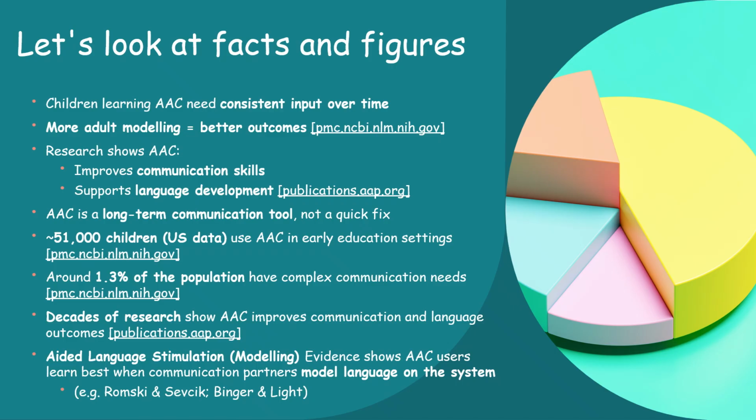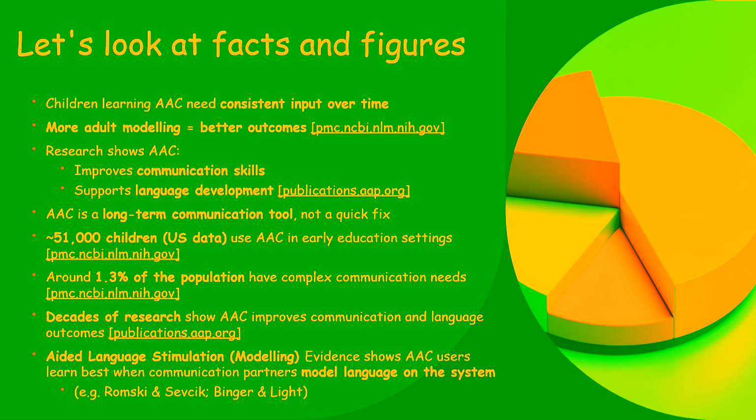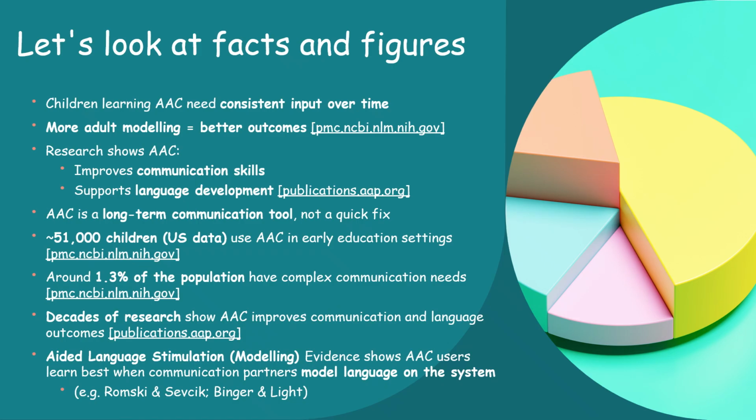So let's just have a look at some facts and figures. This is an area that I get asked about quite a lot from parents and carers and staff, and it's a really good area to have a little look into. One of the most important things to remember about AAC is that it takes time and it needs consistent support. Children don't simply learn to use AAC by having access to the device or having it out on the table or the communication book out on the table. They learn through repeated exposure and meaningful interactions over months, years, and longer than that.